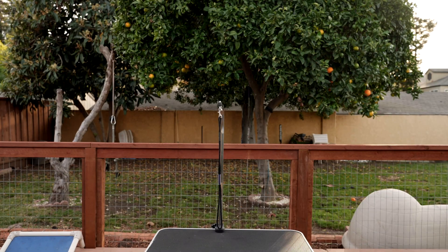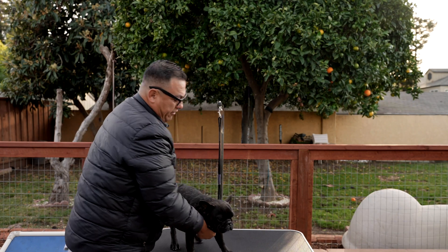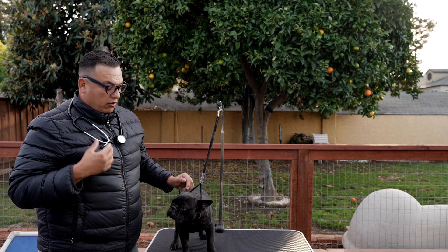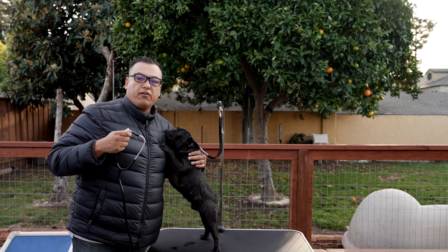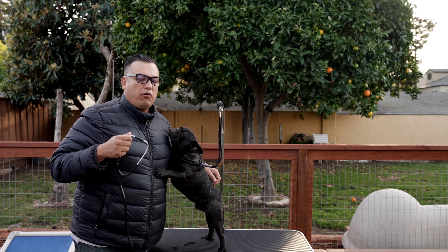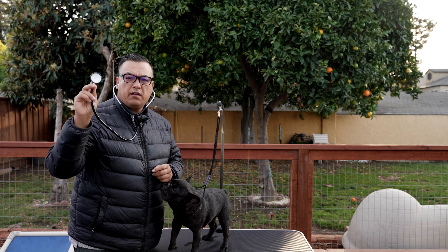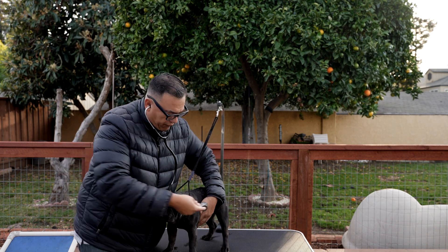Without further ado, let me get the pup — hopefully you guys can see how I physically do a heart auscultation. Many of you have already met little Perry right here. I'll put him up here at the table on this grooming stand. You're going to grab your stethoscope, and hopefully the pup's not too excited or breathing too laboriously. You kind of want to have him in a nice quiet room where there'll be no interference. Put this right here in your ears — here's the sternum — and you want to go in between the one, two, three, fourth rib, right there.